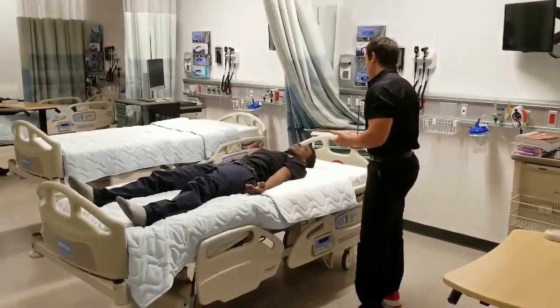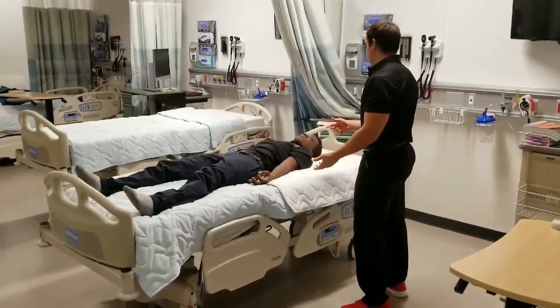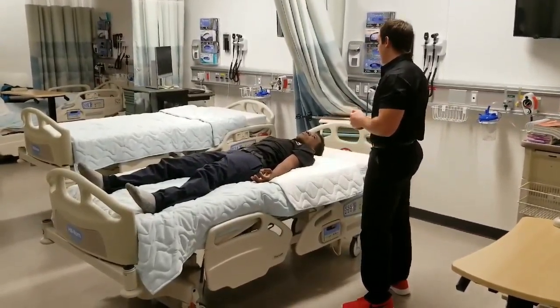Hello, Alan. My name is Austin. I'm your student physical therapist. Is it okay if I move you to sitting upright at the edge of the bed? Yeah. Do you have any pain right now?